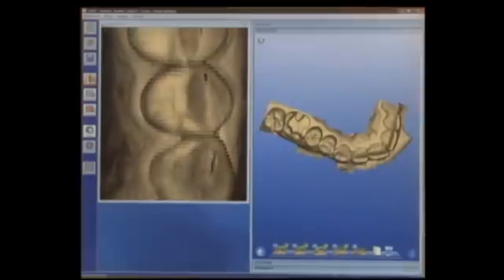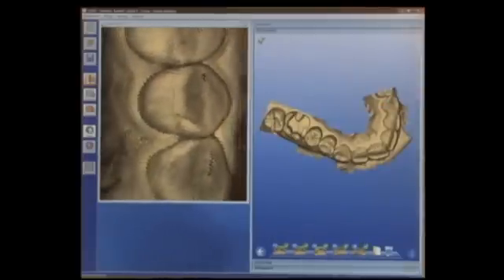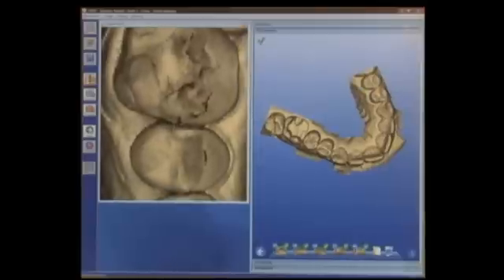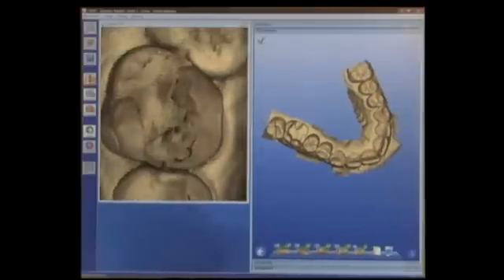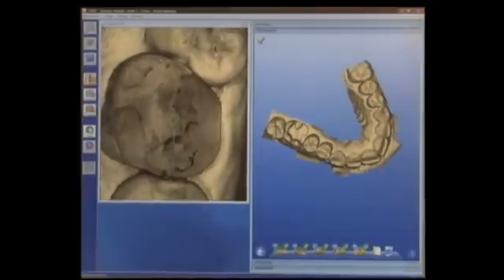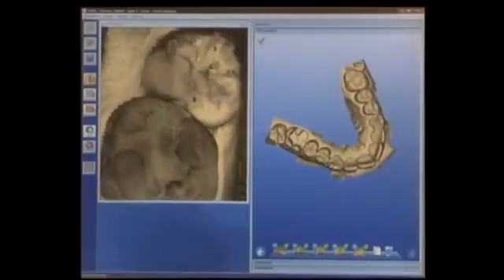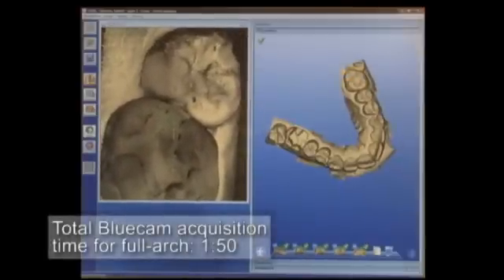Because I'm in live capture mode, we can see that as I stabilize the camera, images are captured automatically and then added to the growing arch on the screen on the right-hand side. We're going to go all the way back to the second molar, and once complete, we'll have a full arch digital impression.